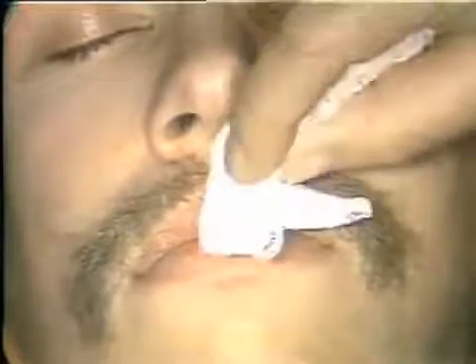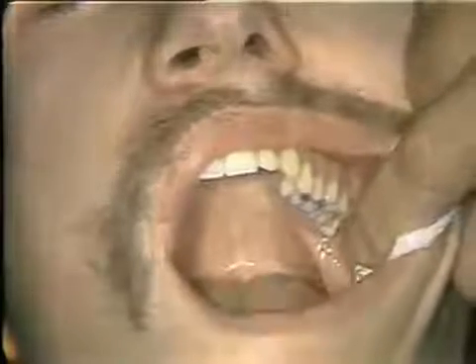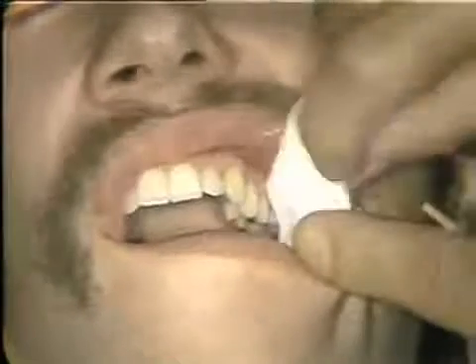This is very similar to the molar infiltration, excuse me, except that we're going to change the position of our needle bevel over the apex of the bicuspid instead of the molar. Just close a little bit for me, and fine. We'll dry the mucosa again, and let us show that we're going to anesthetize the maxillary first bicuspid. A little tincture of betadine on the mucosa.